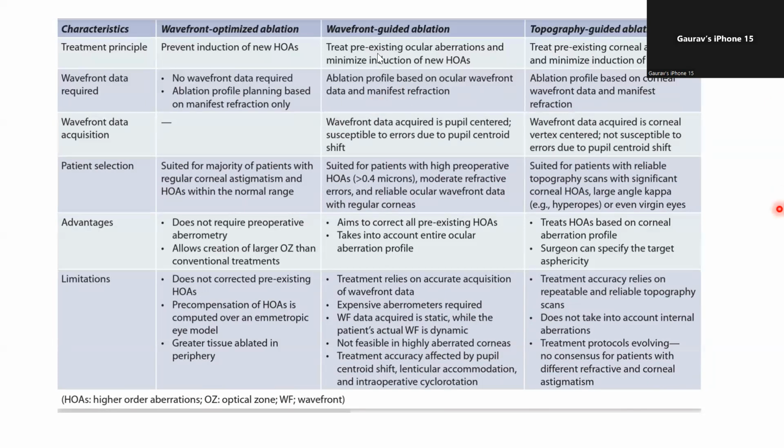That is where the role of topo guided ablation comes in. However, it also has its limitations because the treatment in topo guided ablation relies on repeatable, accurate and reliable topo scans, and it does not take into account the internal aberrations of the eye.